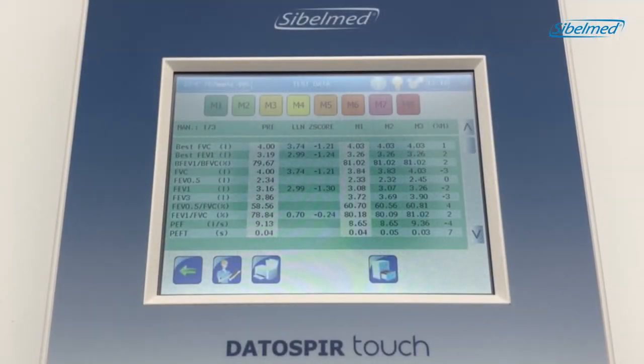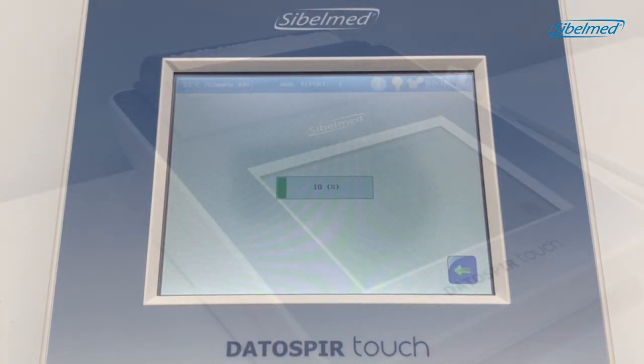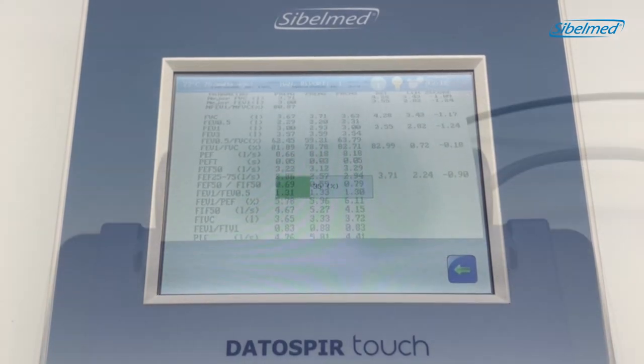Now we will print out a sample of the test. The report can be customized to include information about our medical center, larger graphics, and more. Let's look at the next step.